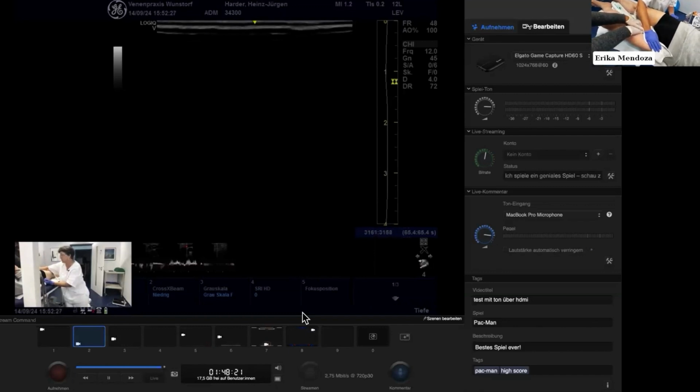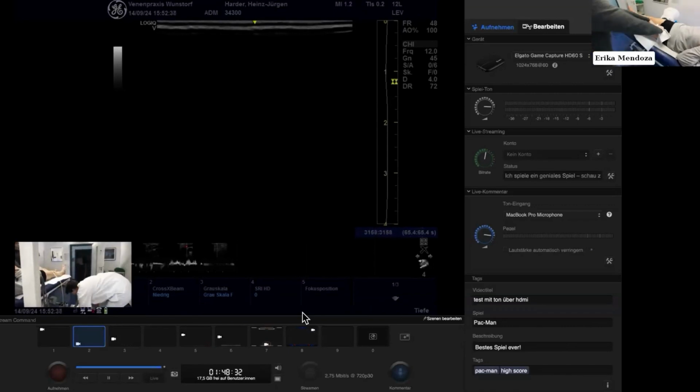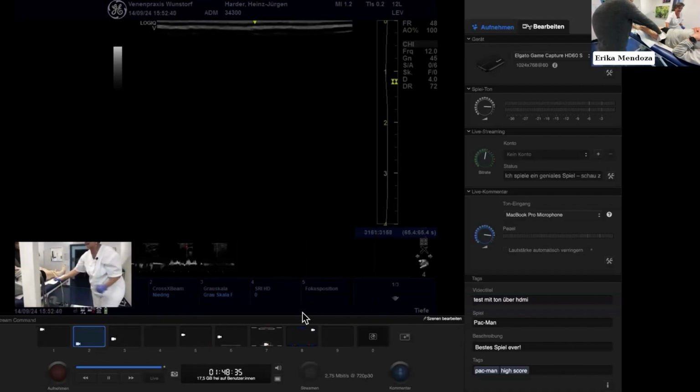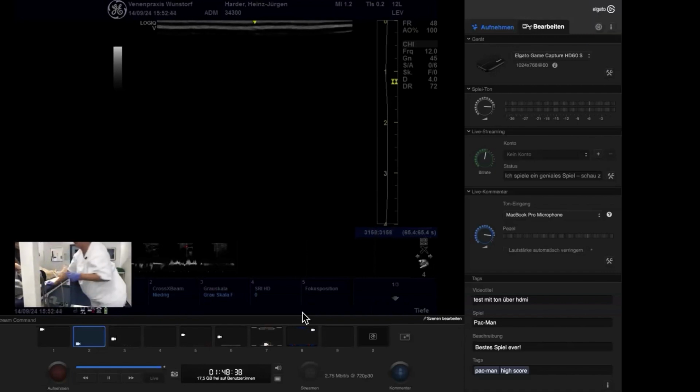Excellent. So what is your trick with the ice bag, Joseph? Ice acts as an analgesic. It acts as a vasoconstrictor, and we also use it for compression. So you can see where Dr. Erika's hand is in the groin. I've got these nice flat cubes of ice, which I use to just gently compress. So you get hypothermia, which basically vasoconstricts. It acts as an analgesic.